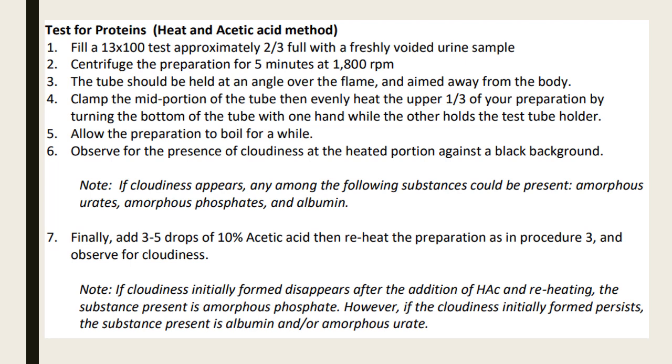If there is no cloudiness that has taken place in your procedure 6, then of course there is no need to do the addition of acetic acid. So that is for your heat and acetic acid test.